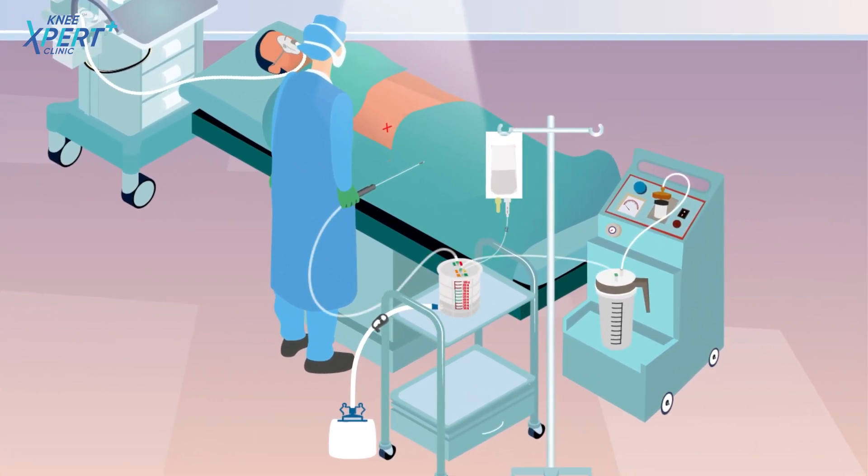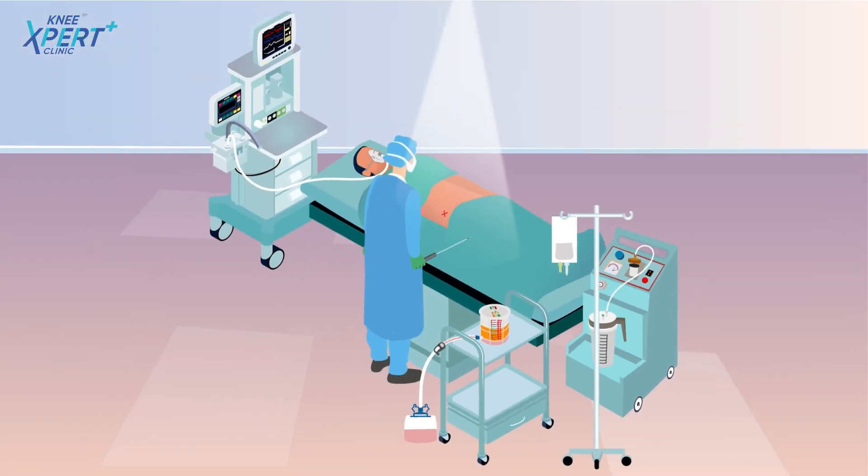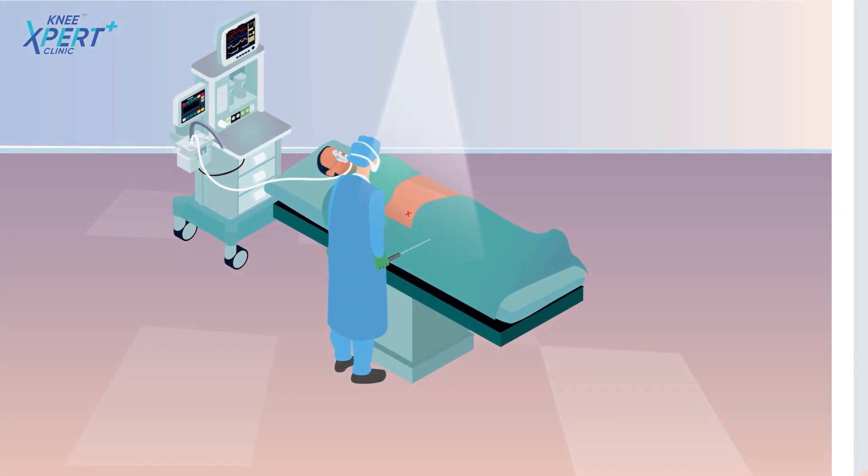A 3mm cut is made at the site from where the fat has to be aspirated, and about 200ml of fat is aspirated from the patient's body through the lipoaspiration process. The cut heals automatically after the procedure in a few days. This is an easy and pain-free process that takes approximately 45 minutes.